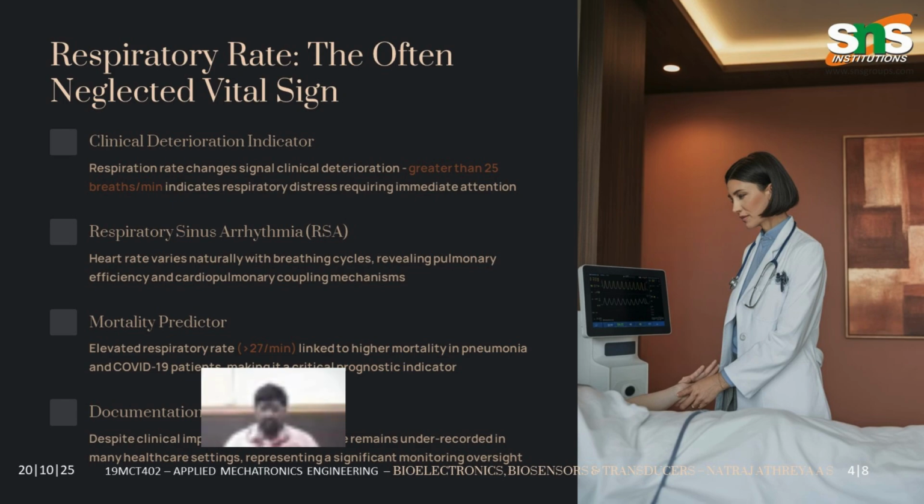The patient will be asked to run on a treadmill, and their vitals, as in the oxygen levels, carbon dioxide levels, and chest compressions, as in the compression and rarefaction of the chest due to lungs expanding and contracting, along with inhaled and exhaled gas values, and the pulmonary, cardiac, and cardiovascular details, will all be recorded to give us a good sense of our respiratory and cardiovascular health.